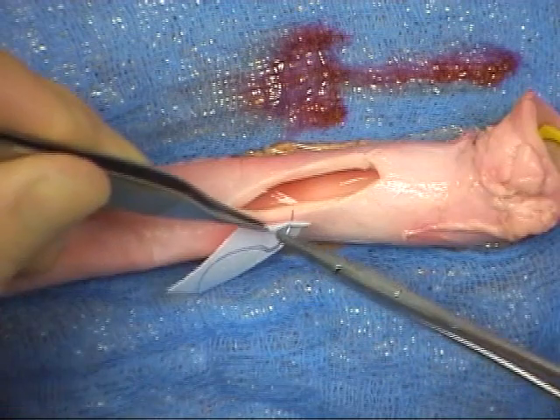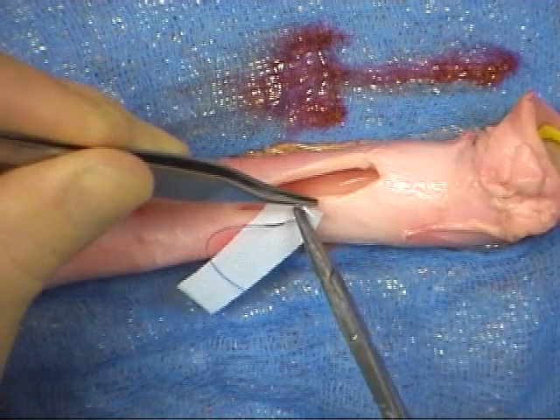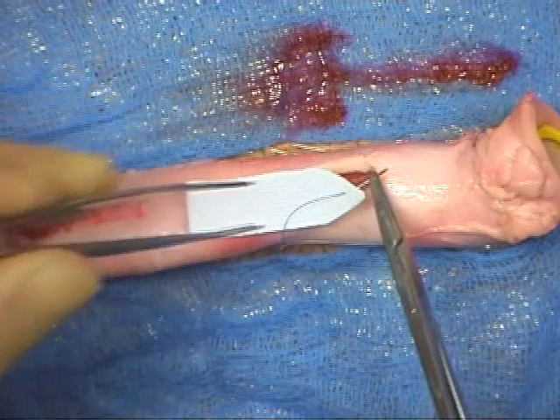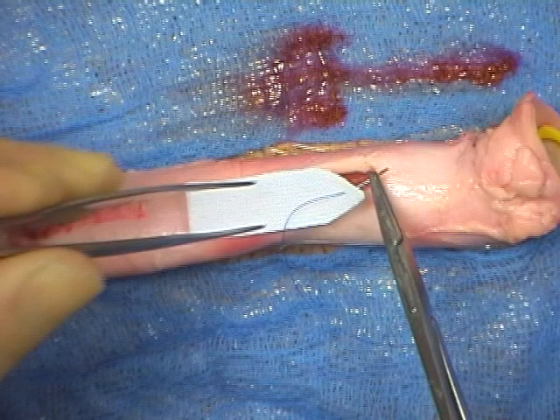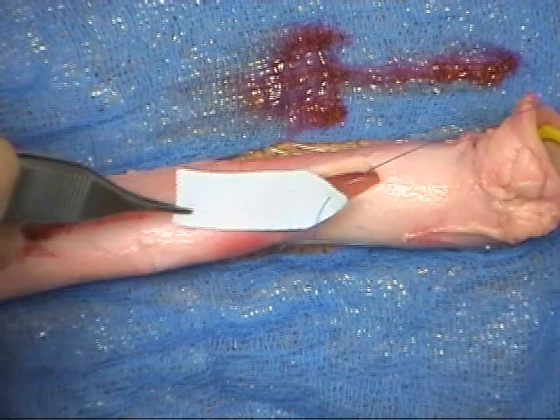Double-ended 4-O-proline, a monofilament suture, will be used to fix the graft into the opening. One needle is held in a reverse grip in the needle holder and is first inserted into the shaped end of the graft. The suture is pulled through the graft as shown.